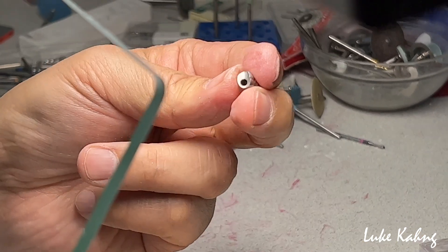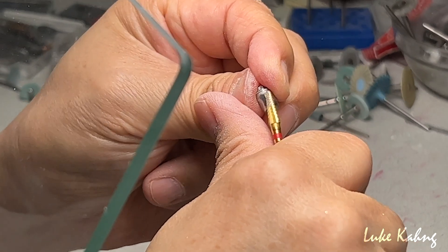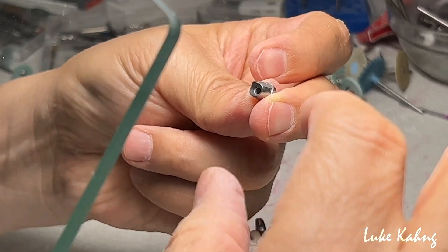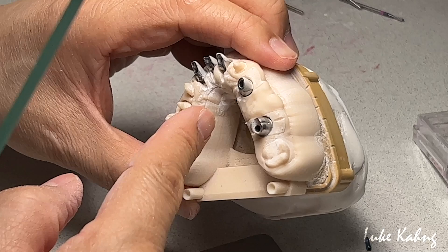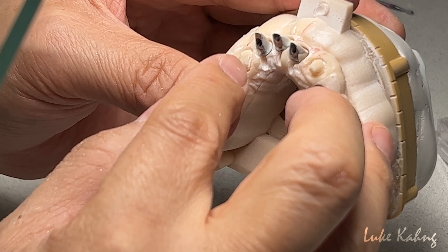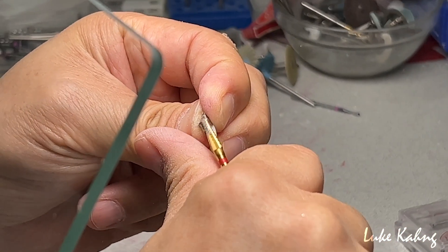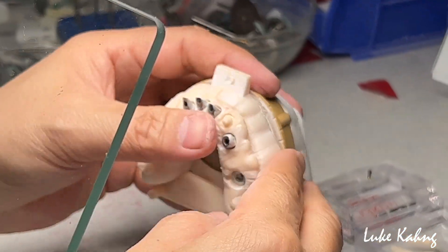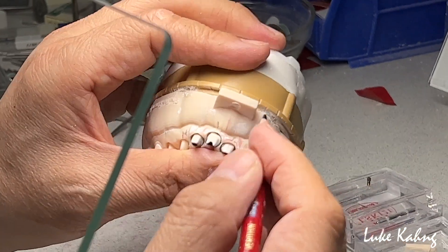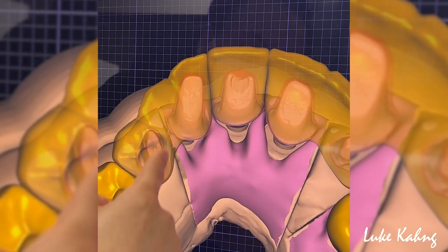This is quite expensive. What's my room? This one I can get better. Before and after — much better. I can see a little bit more improvement. Going to get more scanning one more time, and then I can make a better design. We worry about the Atlantis abutment and the natural teeth — it has a lack of room in between the sections. That one is a problem on the other side as well. So now it's a dilemma.